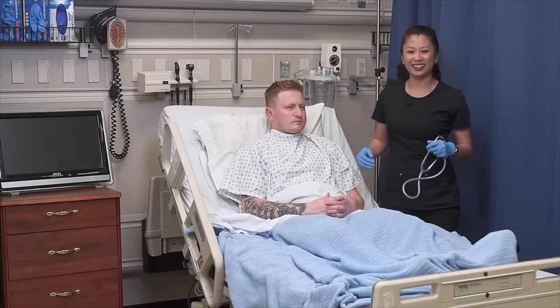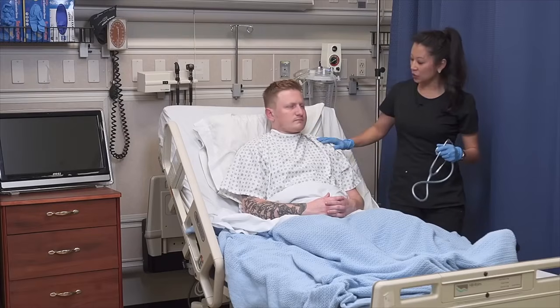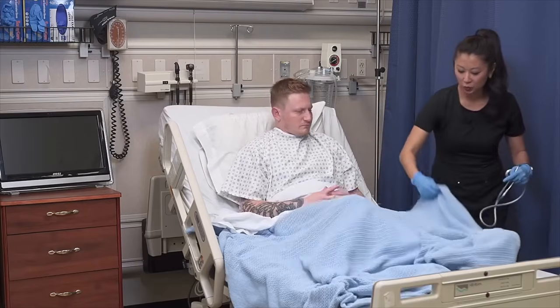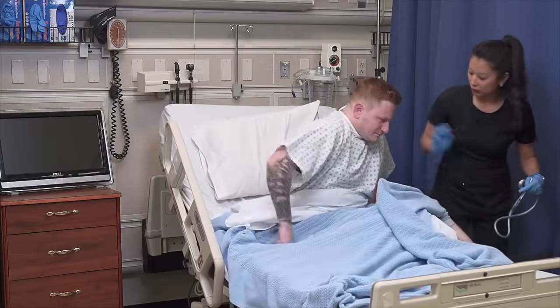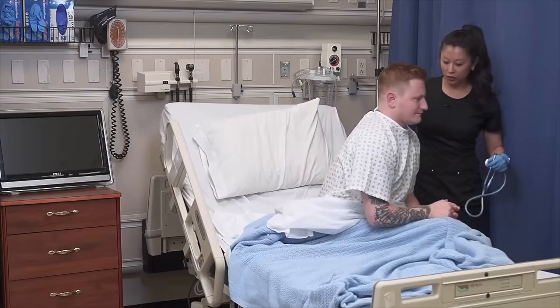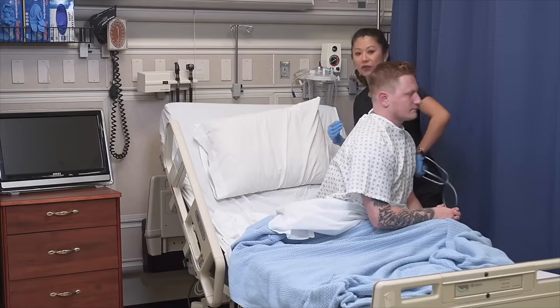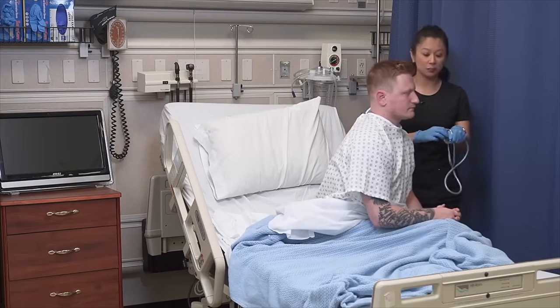I just basically split the sternum there, kind of at this mid-line here. Okay, Brandon, so what I'm going to do is listen to your backside if you would. Do you mind just shuffling your feet in this direction so I can get to your back? Perfect. Thank you so much. Now, if Brandon couldn't do this, you can have him lean up in bed or even roll to his side if you need to access his back.